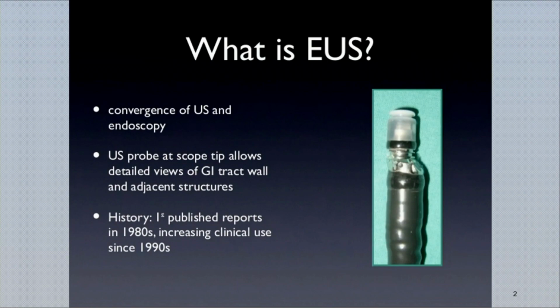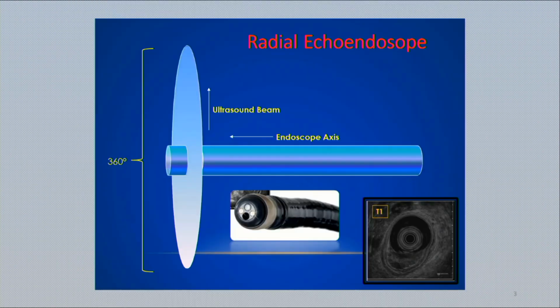Normally as endoscopists we are tuned to seeing colors. We are always trained that we see within the lumen, so we have a tunnel vision and we see colors. But when you combine it with radiology, it becomes EUS, which is endoscopic ultrasound. So it's a marriage of two technologies or two branches of medicine. That's why it has a longer learning curve for any endoscopist, because normally you're trained in endoscopy.